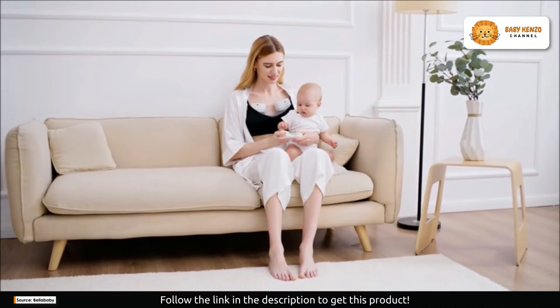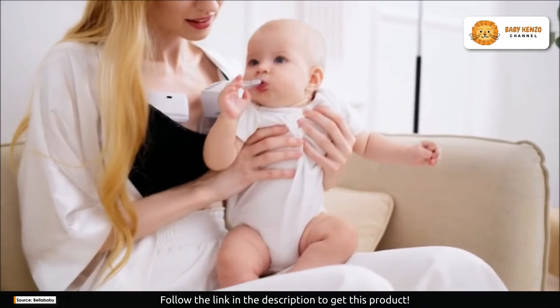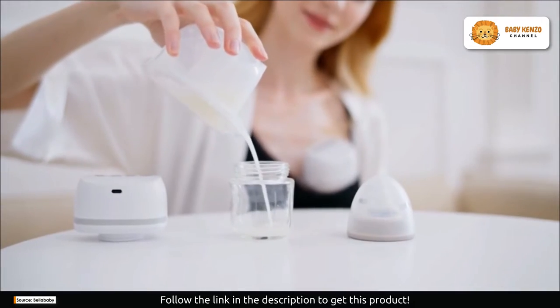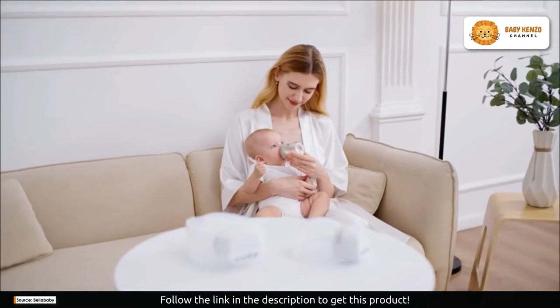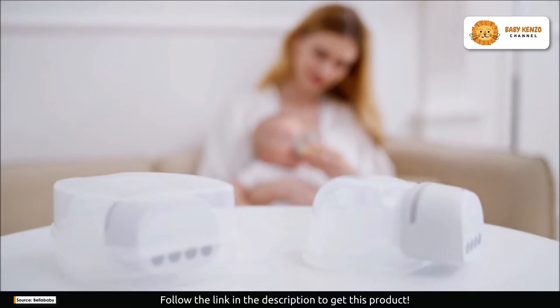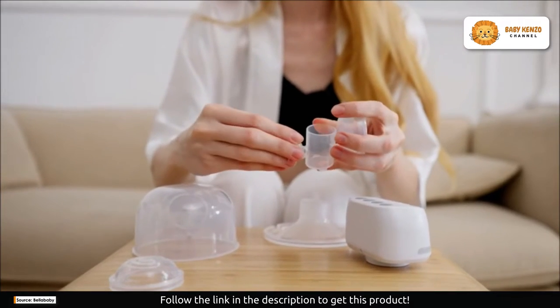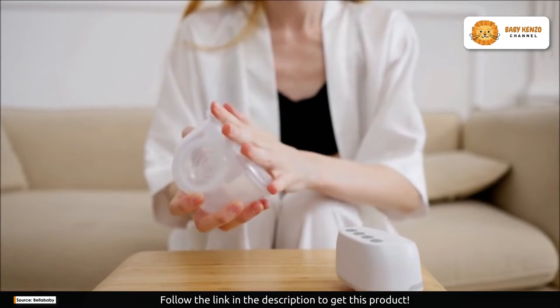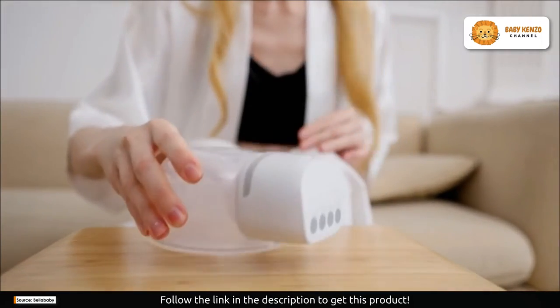Life doesn't stop when you're a mom. That's why Bellababy Wearable Breast Pumps are designed for moms on the move. Pump at home, at work, or while you're out and about. Say goodbye to being tied to a wall or a noisy, cumbersome pump. With the Bellababy W42, you can reclaim your time and do the things you love while pumping discreetly and efficiently.